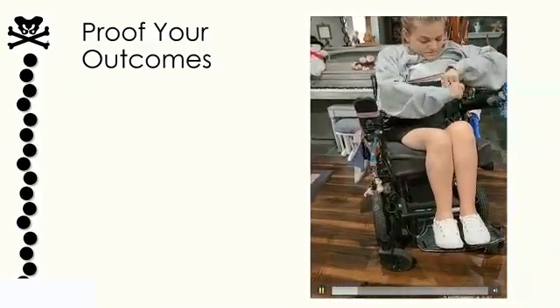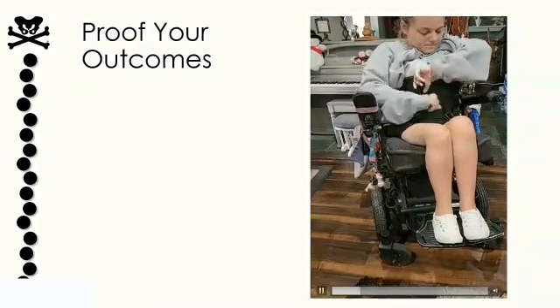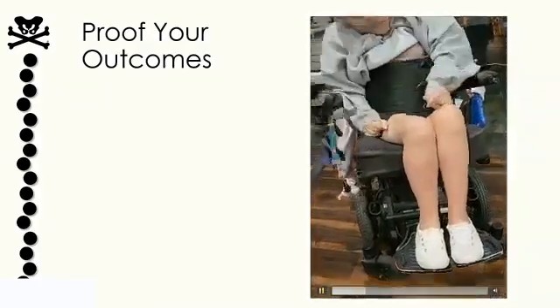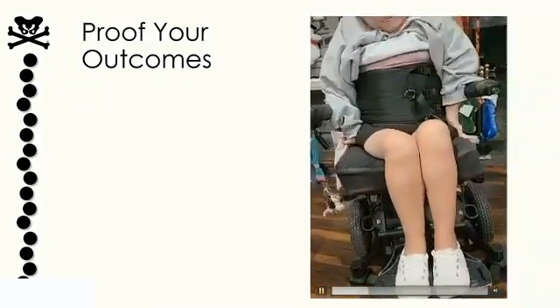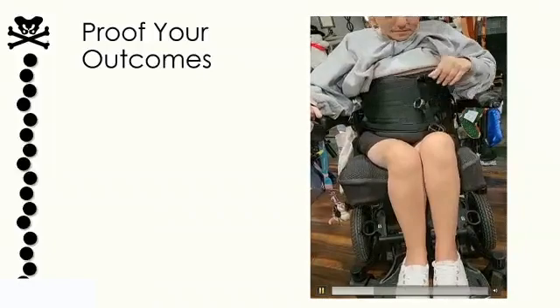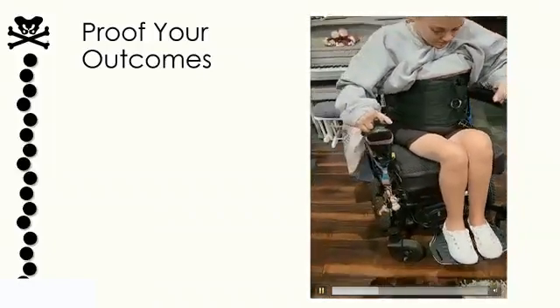She's going to adjust the tension on the belt accordingly to her desired support. This is not something that I determine. It's going to be something that the user determines, and it may change with various functional tasks. So it's going to happen pretty quick here in a second.